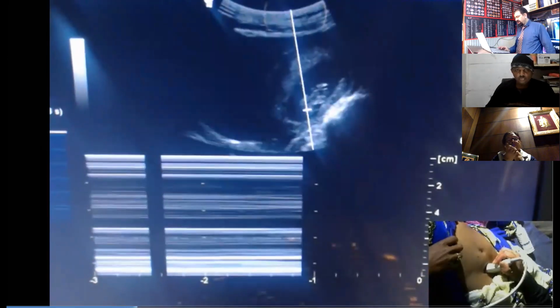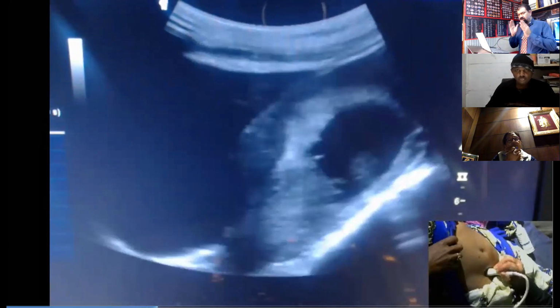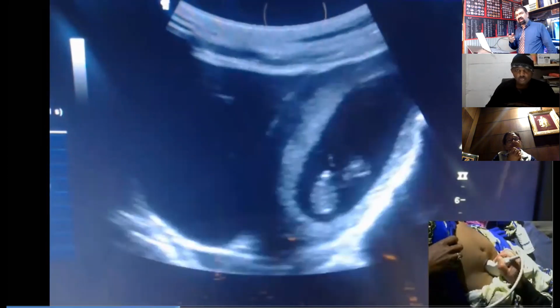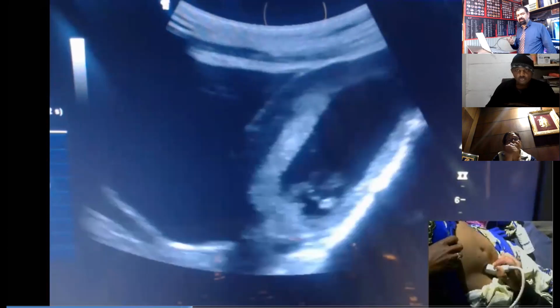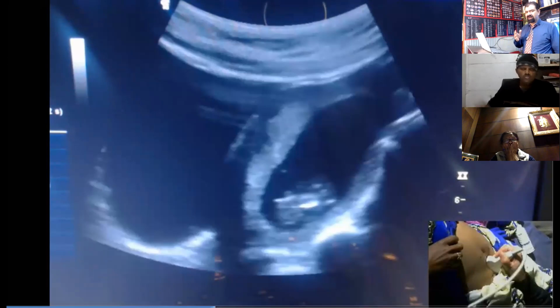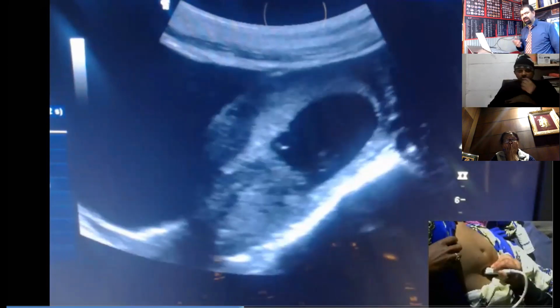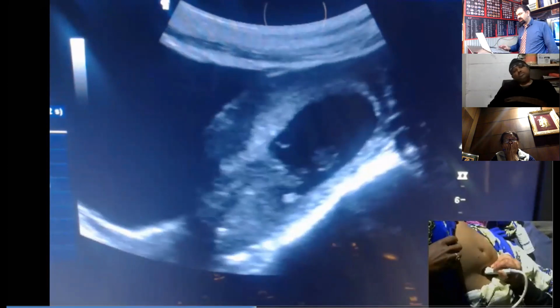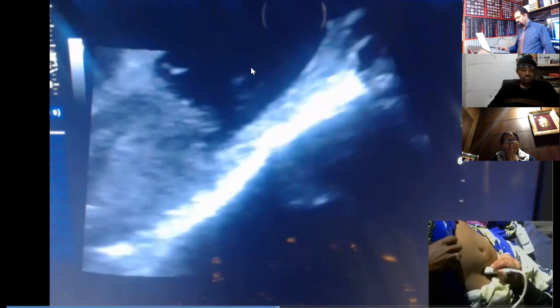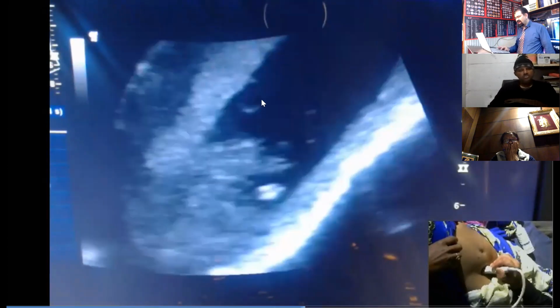So again, demonstrating and repeating, don't take two pulsations, you have to skip one. But in some machines like Philips and some models of Samsung, you have to take it without skipping, I mean without alternating from first to second. So you have to check your machine, and in about 90% of machines, you have to skip one, I mean on an alternate basis.